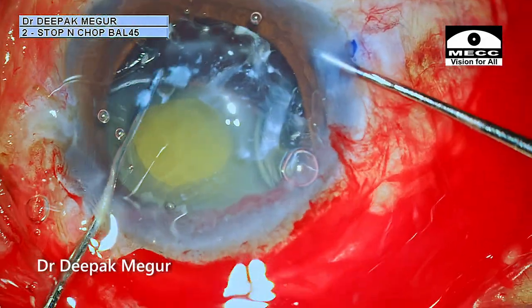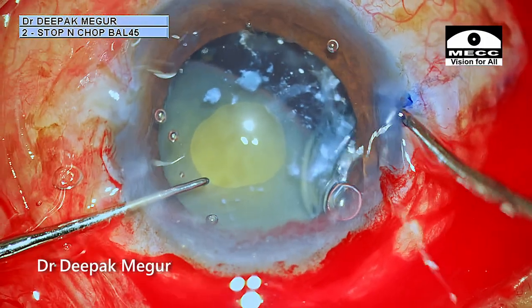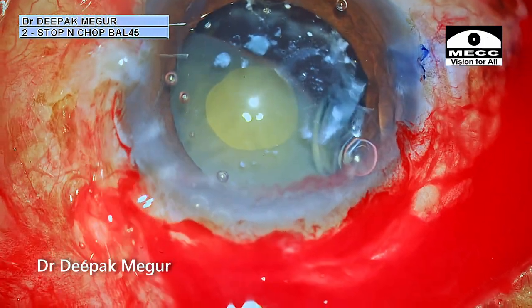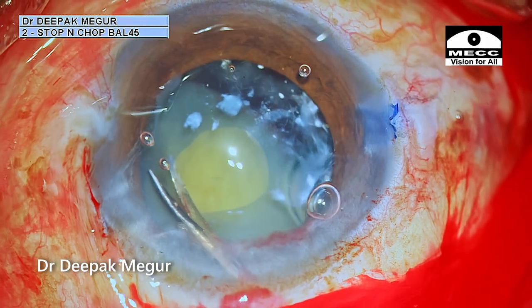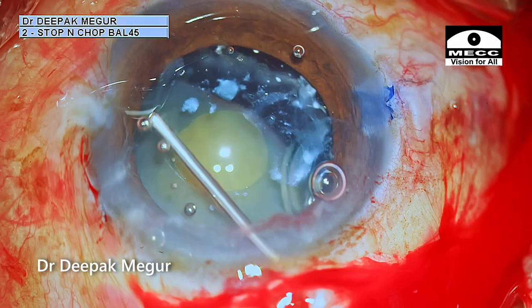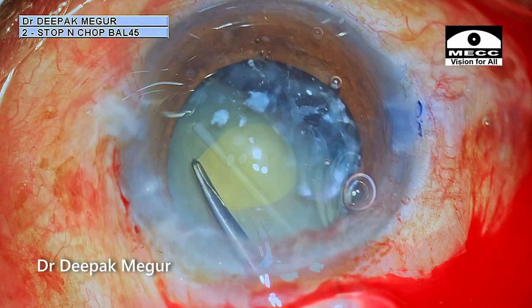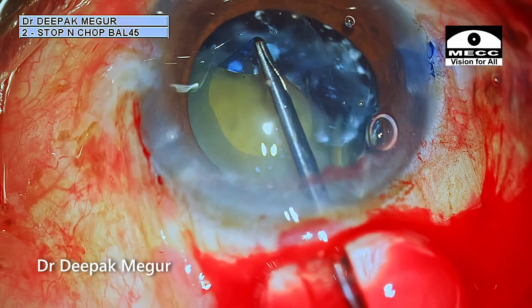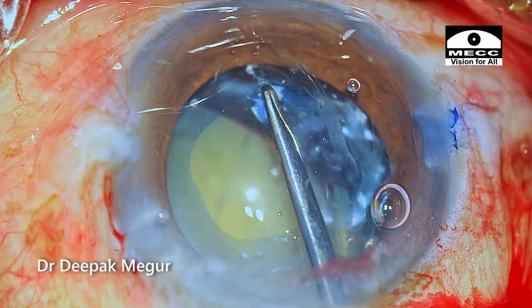Once the CTR gets into the bag, now is the time to enlarge the rhexis. The challenge is to deal with the areas of calcification. I'm making a cut in the opposite quadrant and then trying to negotiate the rhexis by avoiding those specks of calcification.